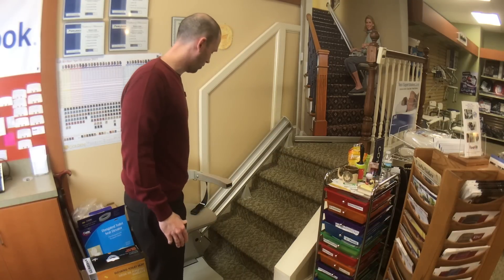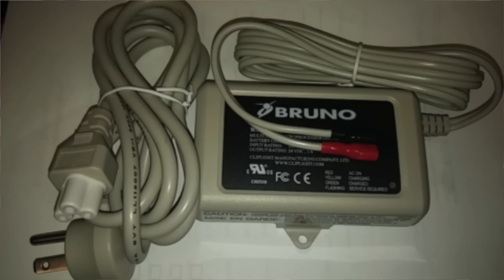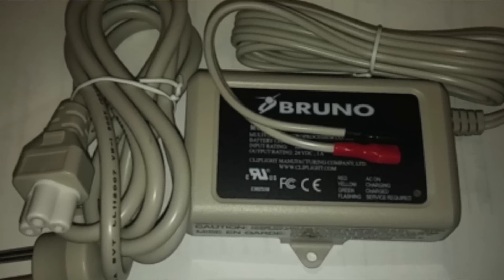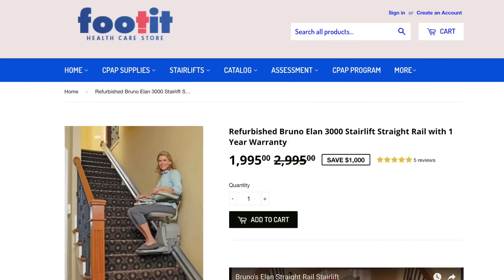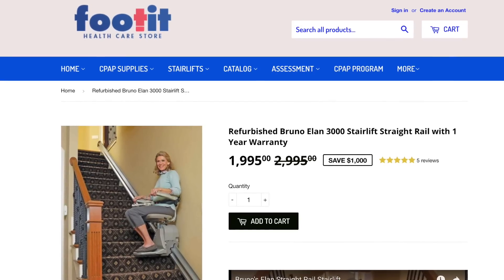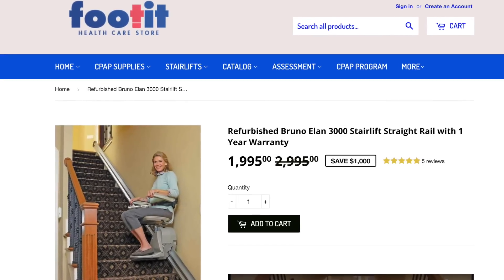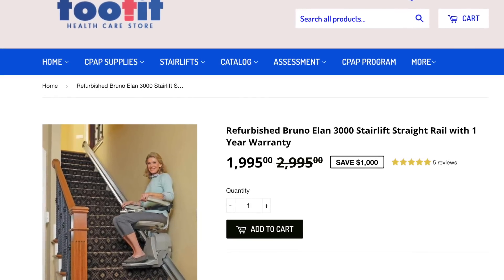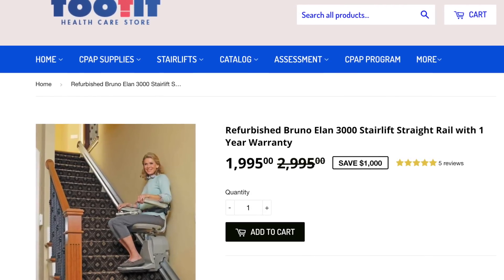The parts you'll most likely need on this are the charger — you could be looking around $200 for a new charger — and the circuit board, which will run you right around $400 if you need that. It's a solid stair lift all the way around. If you go to our website, you can save $100 by typing in promo code BRUNO100. We install within a 60-mile radius.